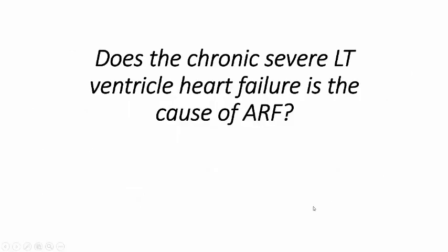Okay. This is a very important question from the advanced critical care ultrasound point of view. Is chronic severe left ventricular failure the cause of acute respiratory failure? Is it the cause of this hypoxia? It's very important to do a hemodynamic study in a patient with left ventricular failure.